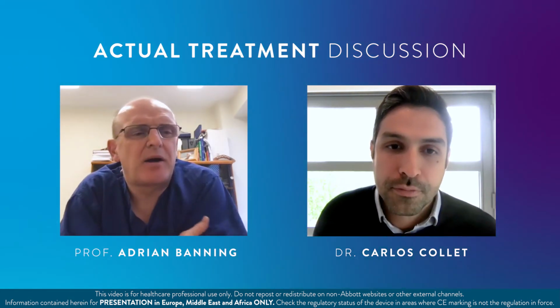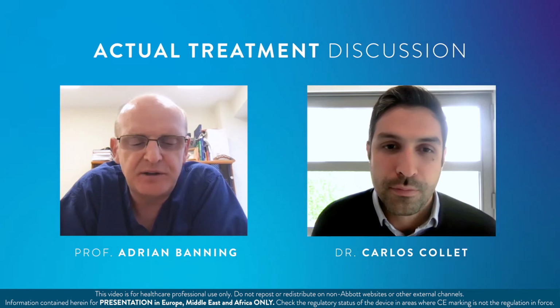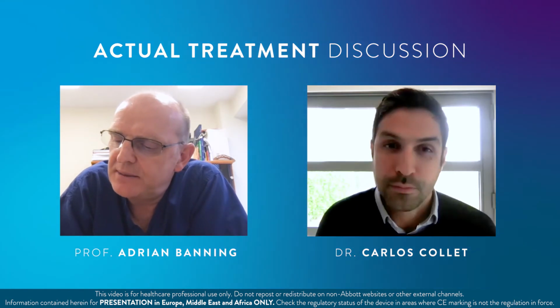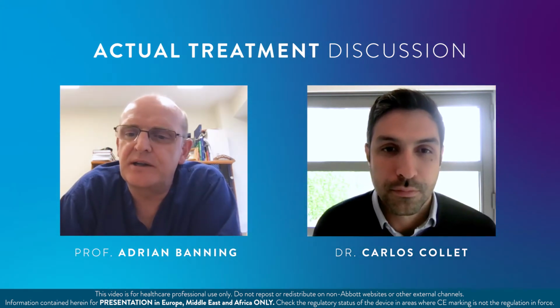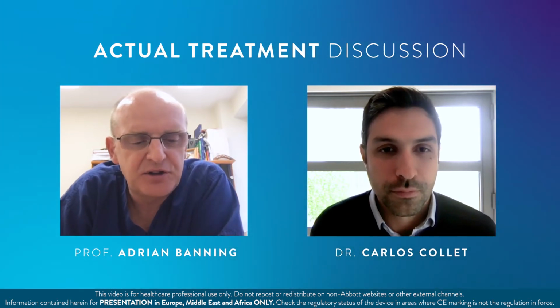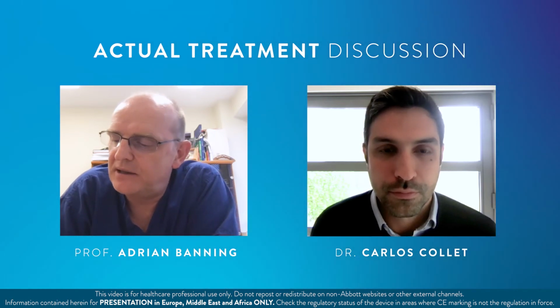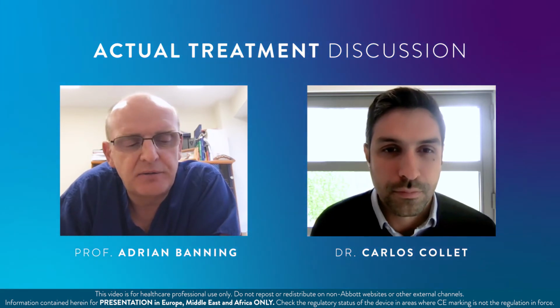And as you say, it doesn't really matter to a certain extent, as long as we get into the distal lumen, and then make sure that we've expanded the area of the bifurcation and the carina optimally, and you obviously got nice images with that. And then making sure that the main branch is right. One of the risks here is that we get our eyes completely transfixed on the ostium of the diagonal, and we forget that making sure that the main branch proximally is optimized is hugely important, and there's lots of good data confirming that statement.